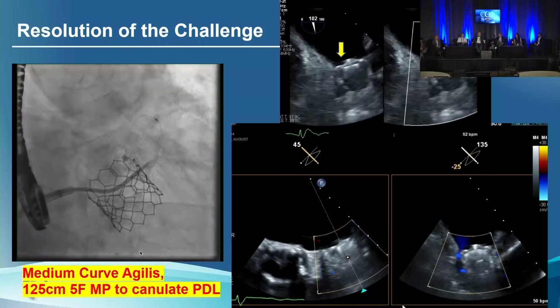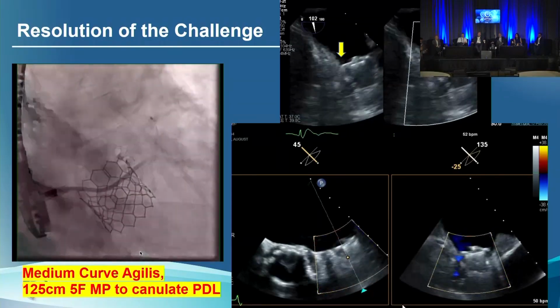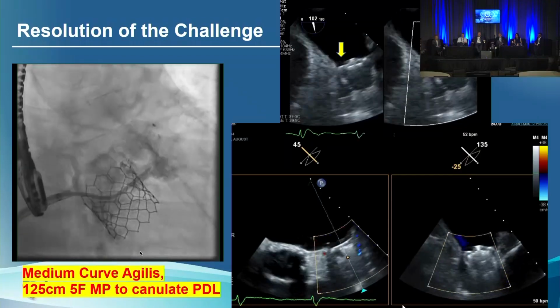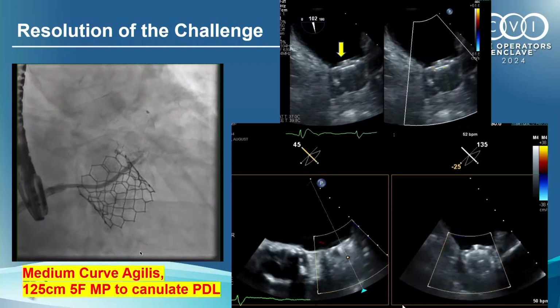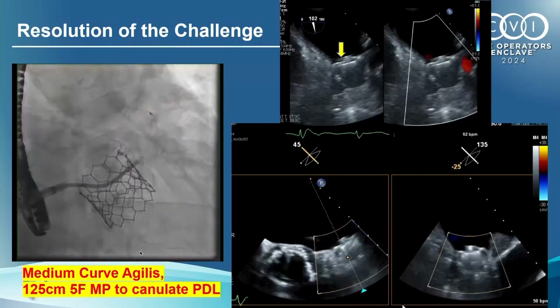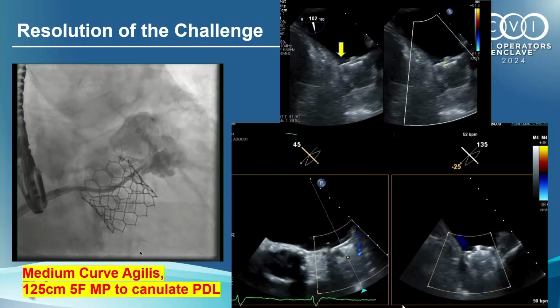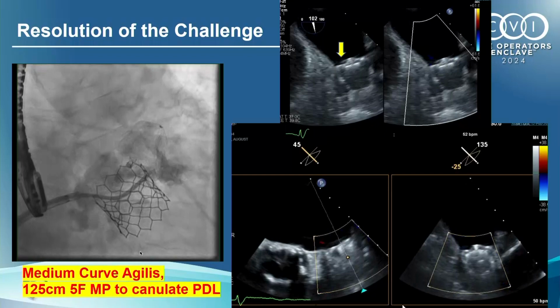So as you can see, the neck of this leak is very narrow. So see how it could be missed, but the body or the sac is pretty big, and there's just constant flow that our structural imager was able to see on the bottom right. So quite a large leak now that we know it's there.